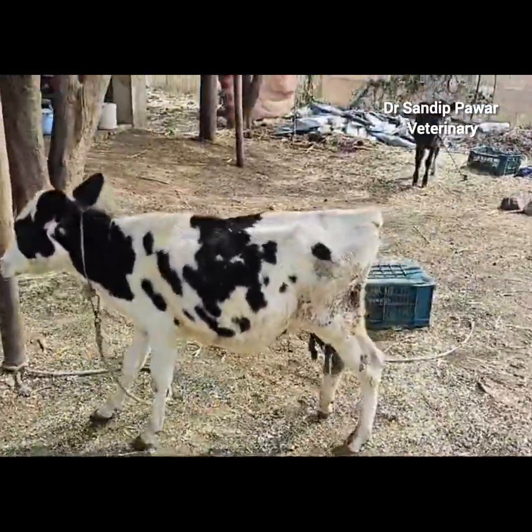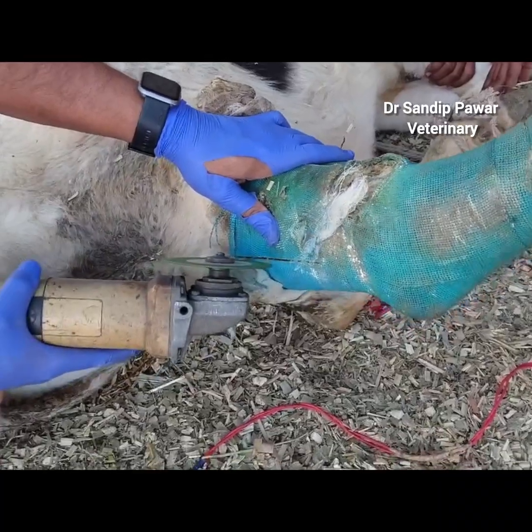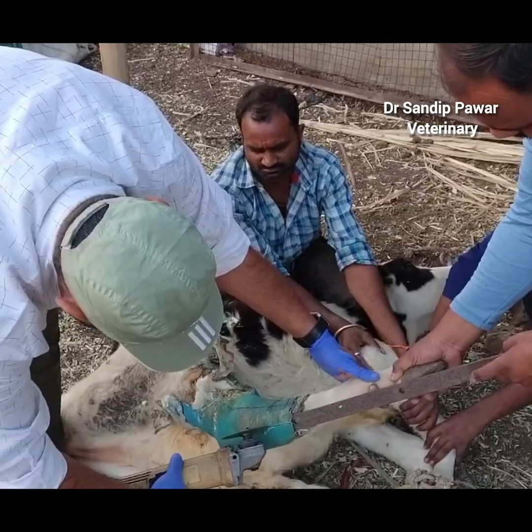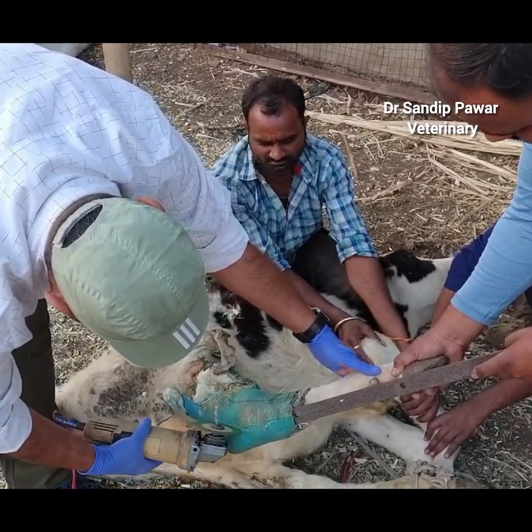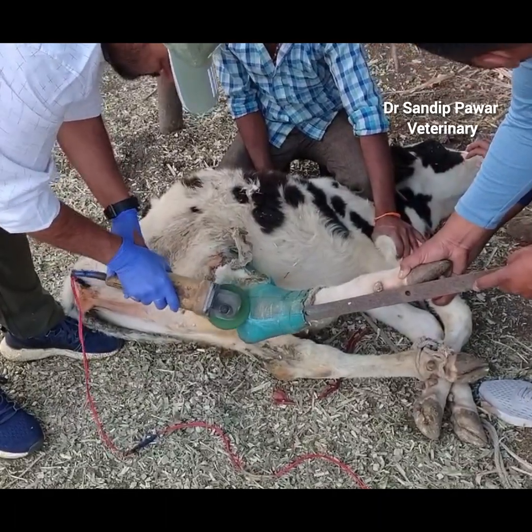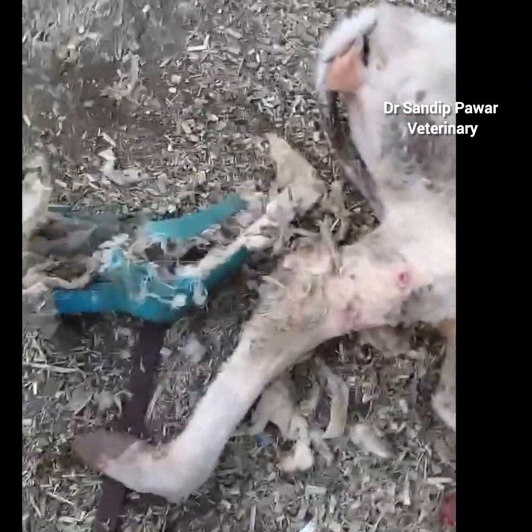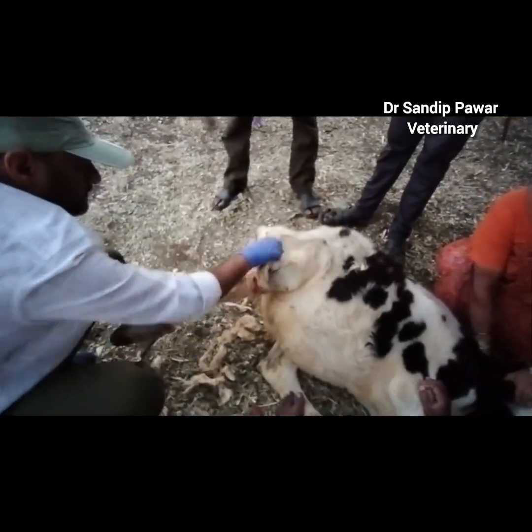After 45 days, the fiberglass cast was carefully removed, revealing complete calcification of the tibia fracture. Minor skin irritations at the cast's upper edges were treated, and the calf began bearing weight on the affected leg.